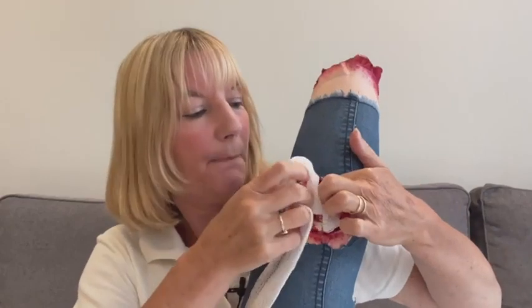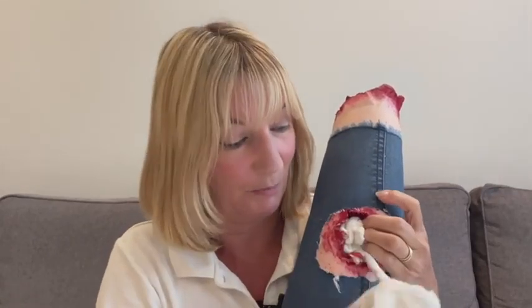That means that when you are packing into the wound, you can use your finger, find the source of it, and you can then pack on top of it, applying pressure as you go to fill up that hole, so that when you have filled it up, it's nearly there. Obviously you would be doing this with more pressure, and you would be looking at what you are doing as well, rather than me trying to do it while I'm explaining to you. The gauze that you would use doesn't have a pad on. I'm just demonstrating with a dressing.